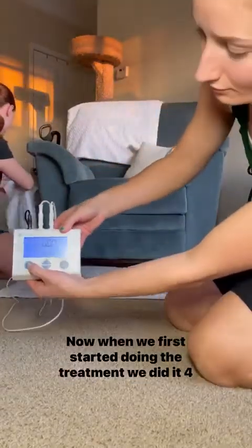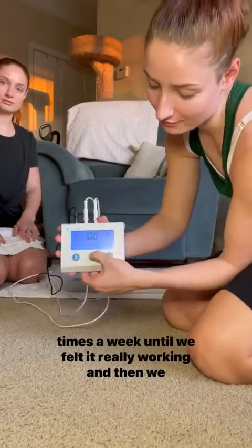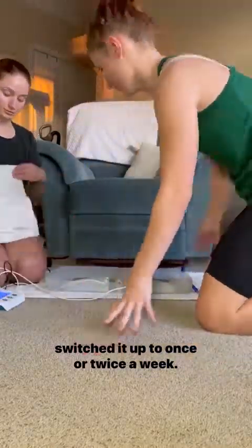Now, when we first started doing the treatment, we did it 4 times a week until we felt it really working, and then we switched it up to once or twice a week.